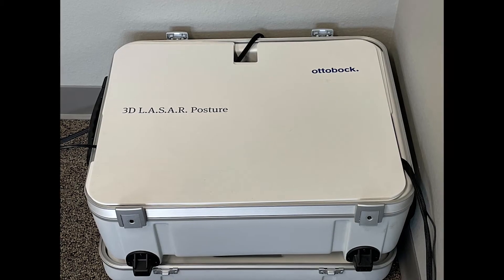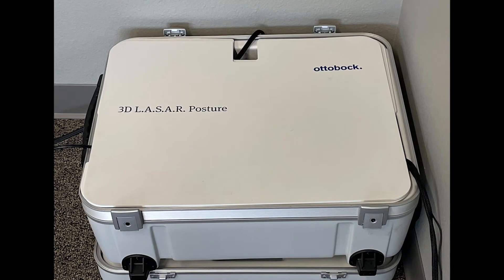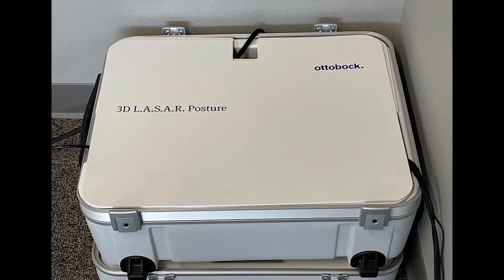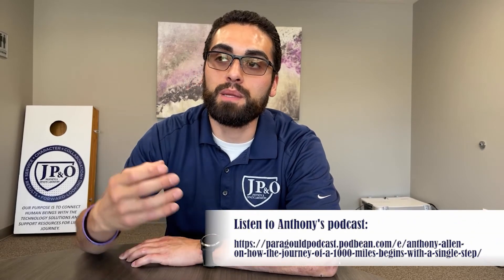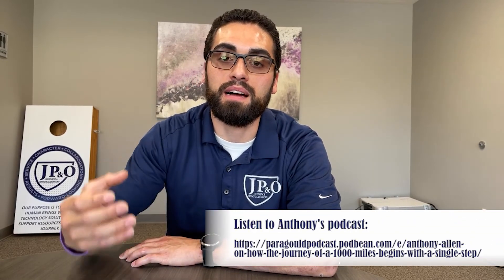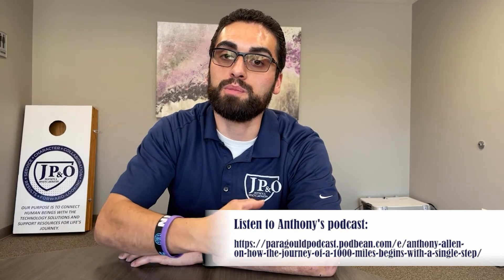The LaserPosture is a device that we use to help optimize our patient alignment. I'm going to walk you through that process and show you what that looks like, and then tell you what this means for you as the patient. When I speak to prosthetic alignment, I'm referring to the biomechanics of the individual — whether the pieces of that prosthesis are aligned so that the individual has forces distributed over them in the best possible manner.